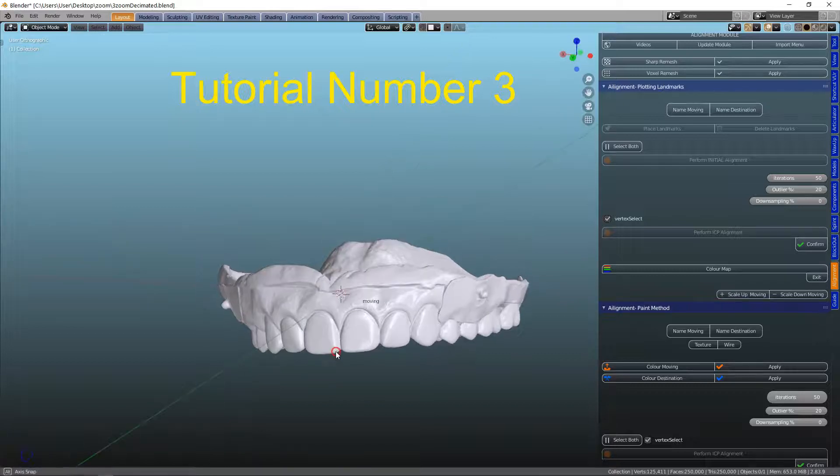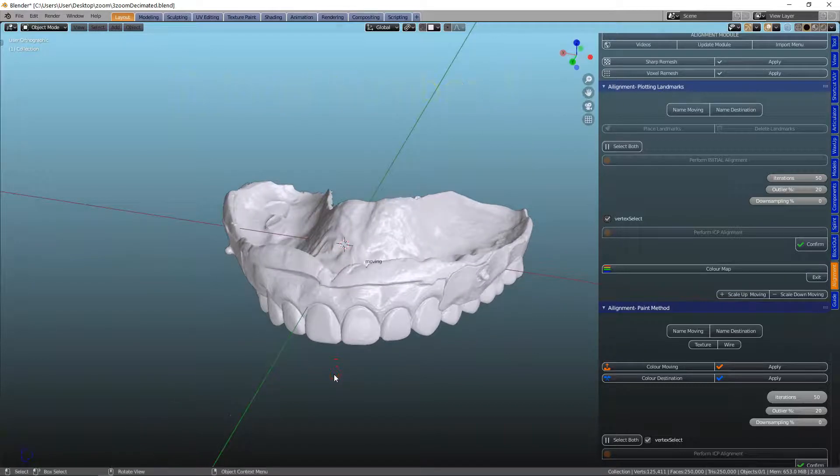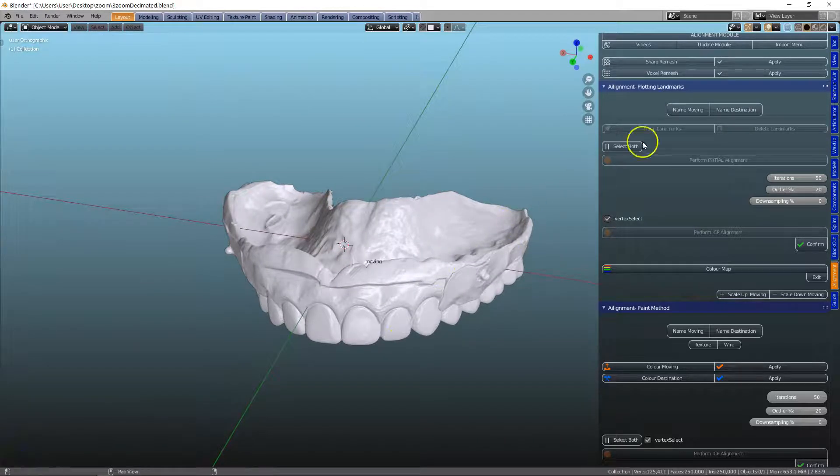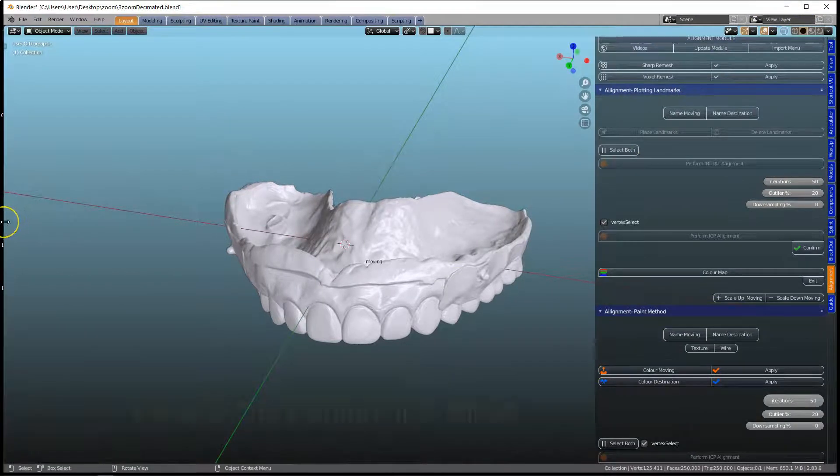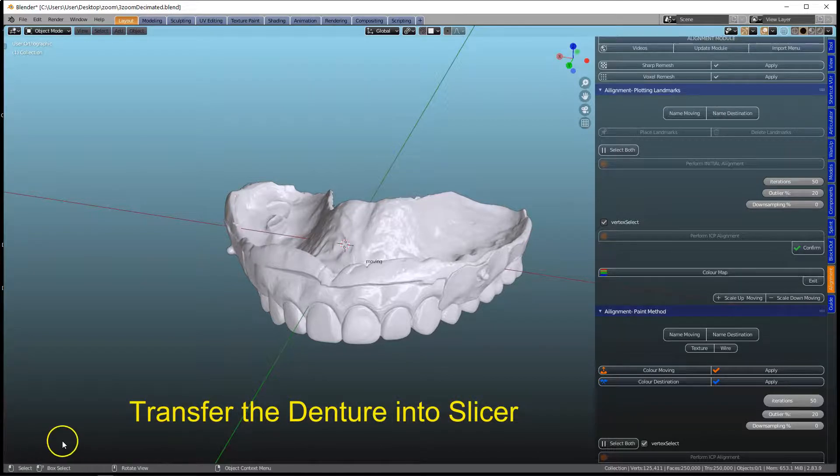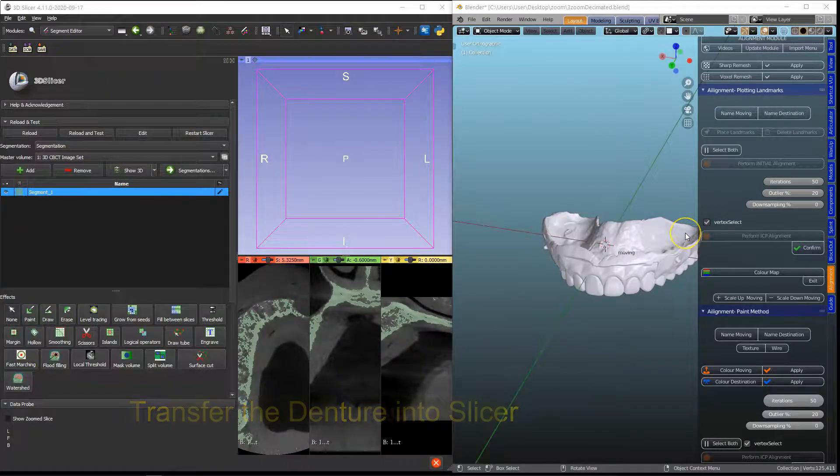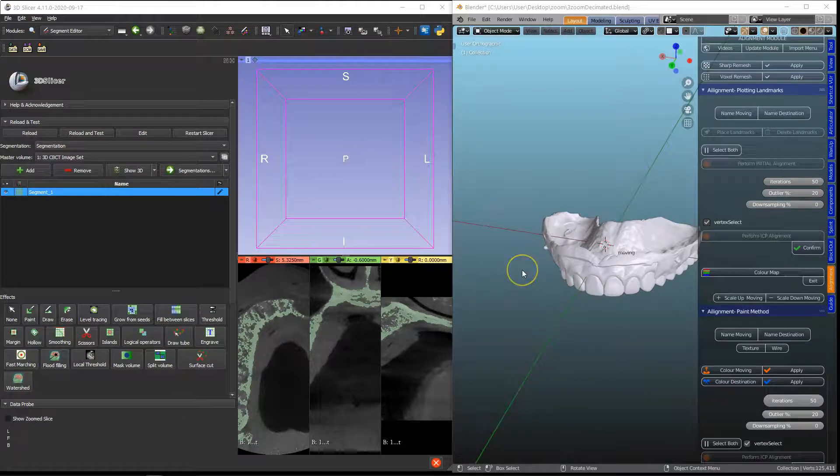Now we need to transfer this denture into 3D Slicer. I'm going to minimize my windows and set the scene. I have 3D Slice on the left and Blend on the right.